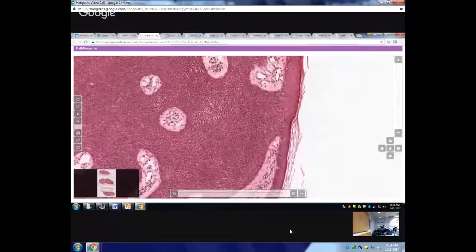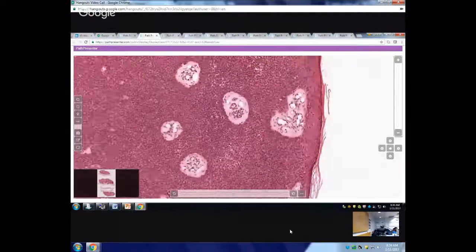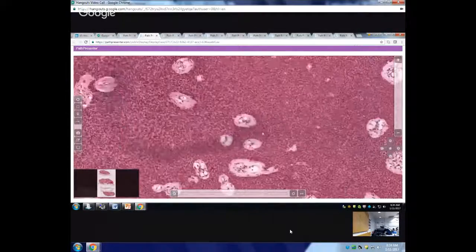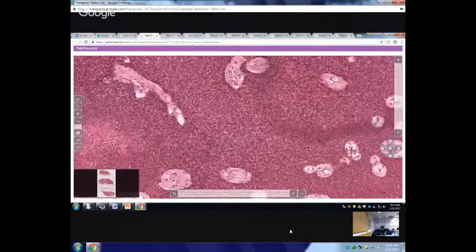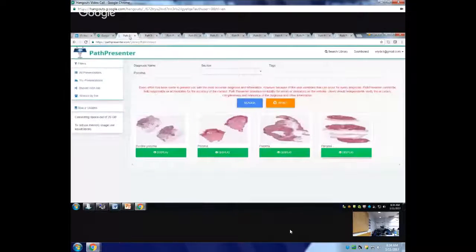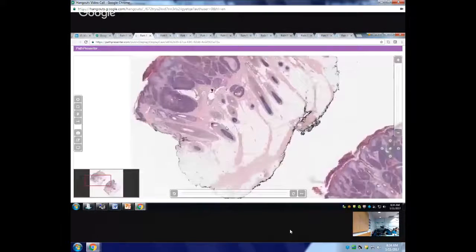Again, the sharp demarcation at the edge. Look at this, the sharp demarcation at the edge. A lot of blood vessels in the stroma. And then you're going to look for ducts. If you don't see the ducts, you can do a CEA to highlight the ducts. So this is an eccrine poroma. Ducts should be part of the lesion, within the tumor. This is another one here.